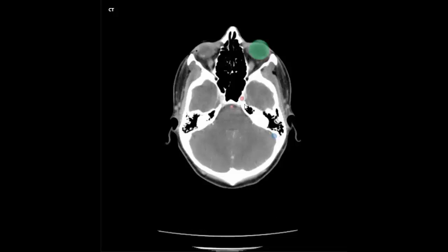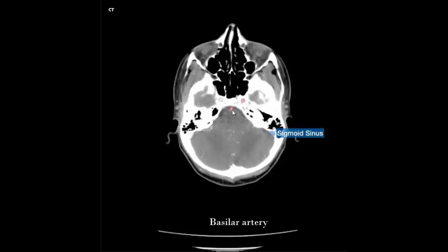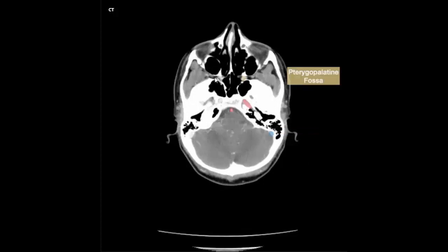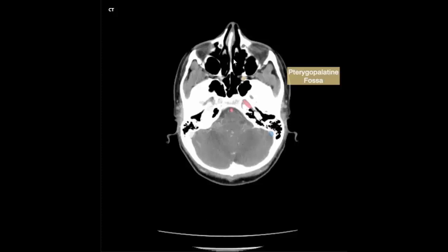Suprazygomatic temporalis muscle, internal carotid artery, basilar artery, sigmoid sinus. Sigmoid sinus, right and left internal carotid artery, basilar artery, right and left maxillary sinus. Right and left pterygopalatine fossa, right and left internal carotid artery, basilar artery, nasal septum, nasal cavity, right and left maxillary sinus, right and left temporalis muscle.